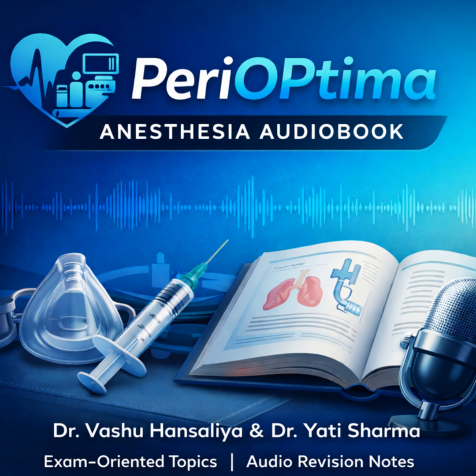Okay, so PIP is the highest pressure reached during the breath. And P-plat is the pressure in the alveoli when flow stops, like during an inspiratory hold. So what's the clinical significance of the gap between them? This is the diagnostic money shot. PIP reflects resistance and compliance. P-plat reflects only compliance. So if PIP is high, but P-plat is normal, the problem is resistance.